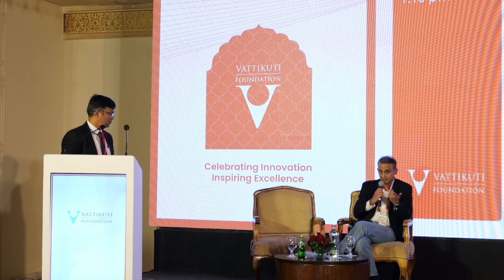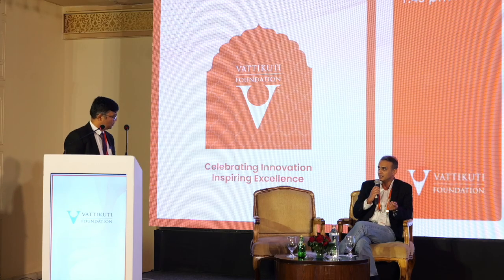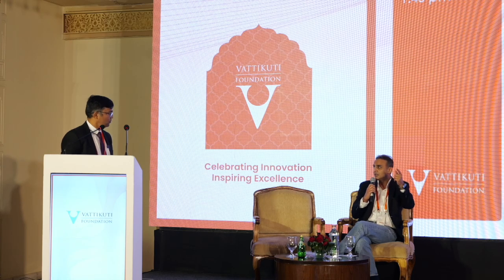Number two is, in such patients where there are a lot of collaterals, I think angioembolization within 24 hours before helps. We have done it in a couple of patients, and it really makes your life easier. And using a Satinsky clamp, especially at the distal end of the IVC, gives good control.